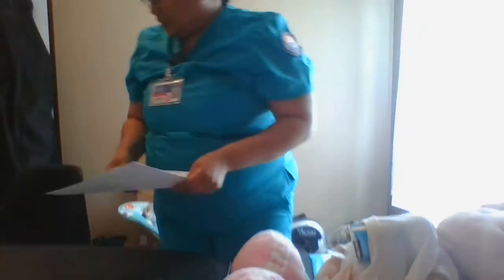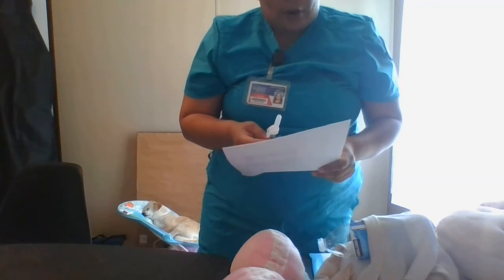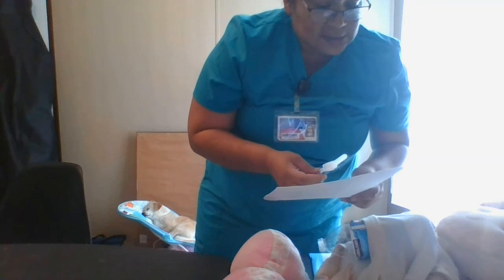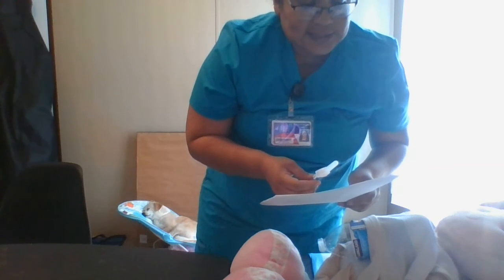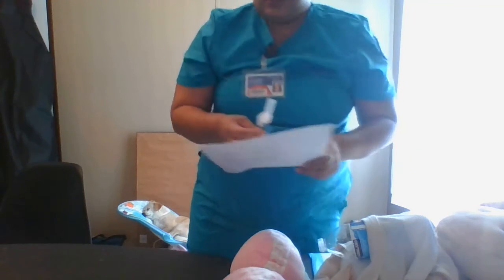So now I'm doing my third check. I'm comparing my medication to my doctor's orders, to my MAR, and to the patient. So I have 5,000 units per 1 ml of heparin that I'm going to be giving subcutaneous in the outer aspect of my patient's arm.